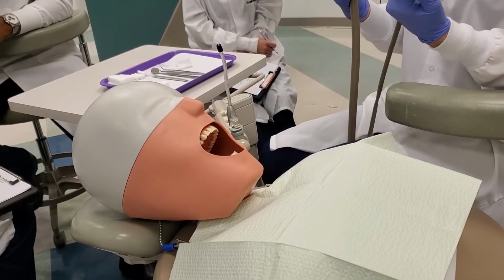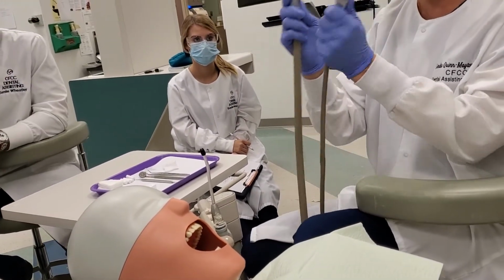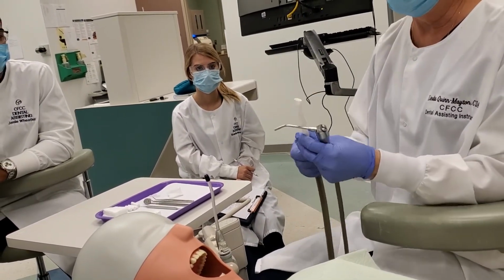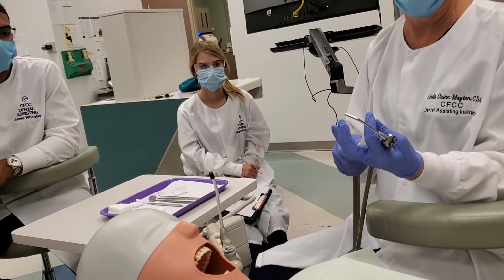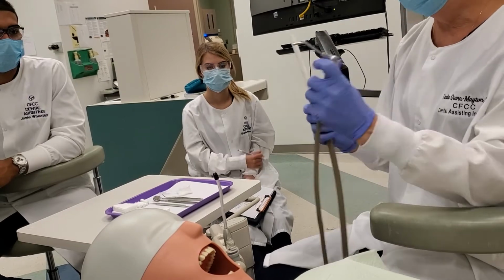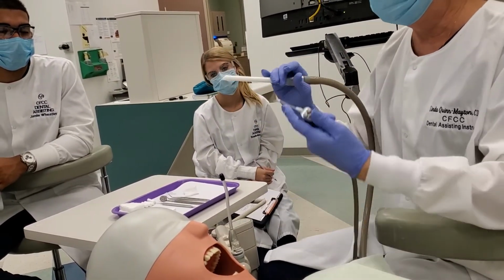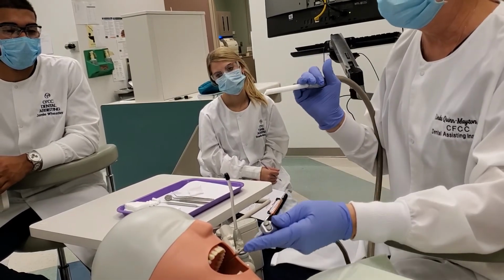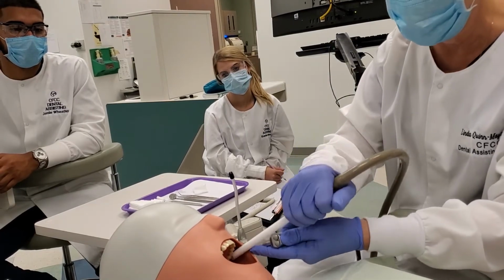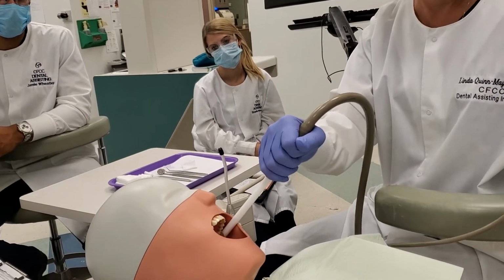I want you guys to get in the habit of having these two always in your hands. Okay, this is chips and dip. These two go together. See how this is a beveled edge and the tip is here? This is super sharp. It can cut the patient's tissue. So you want to be able to place it, not just jam it in there. So the air water tip is good because you can use it to retract and then get into a good position and then come out with it. And the patient will appreciate you, trust me.